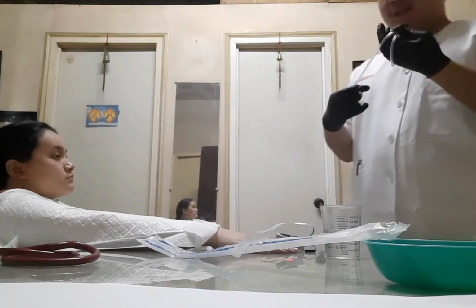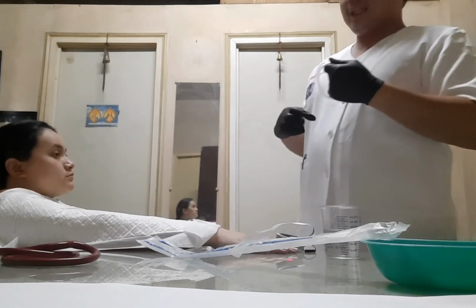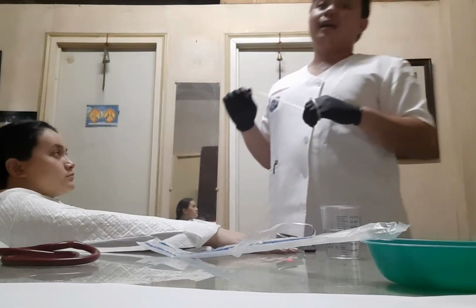And then after doing this, we'll do it like this so that we will maintain the sterility of the suction catheter. Because as I said earlier, my dominant hand will be the sterile part, and my non-dominant hand will be the unsterile part.